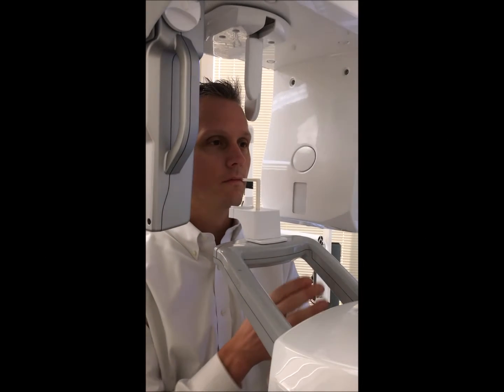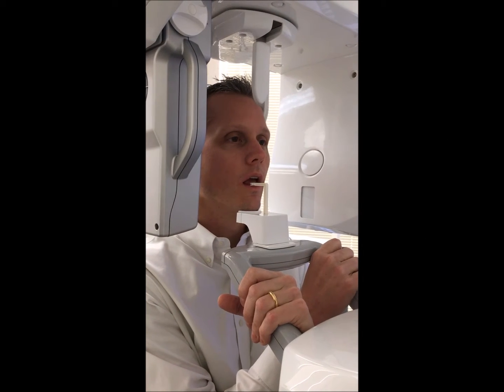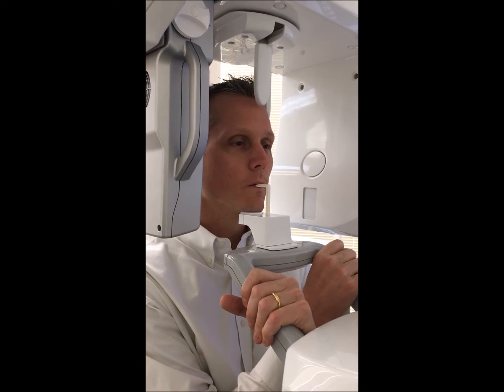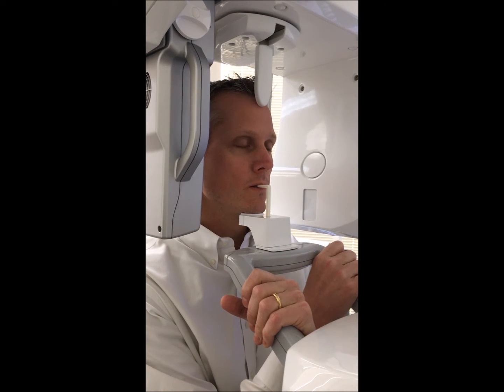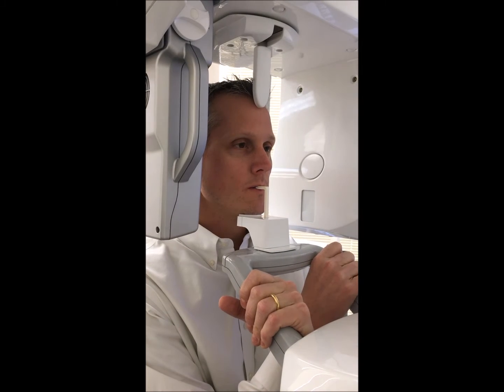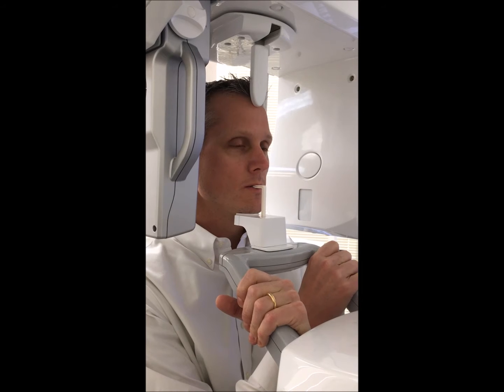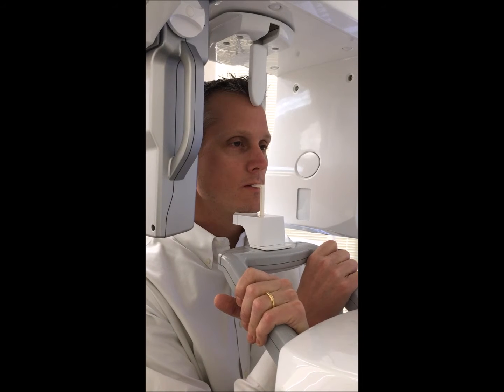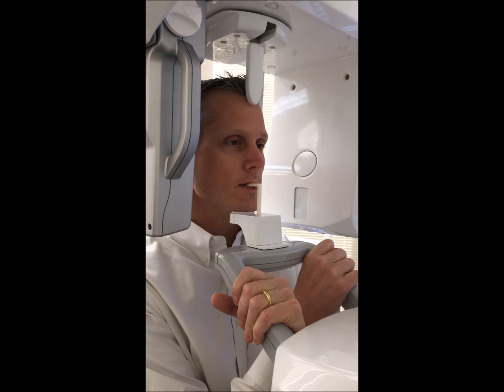Have the patient step into the machine, rest their chin on the chinrest, and bite gently on the bite stick. We recommend that the patient cross their arms and hold the stabilizing bars. This allows the patient to drop the shoulders, which expands the spine.